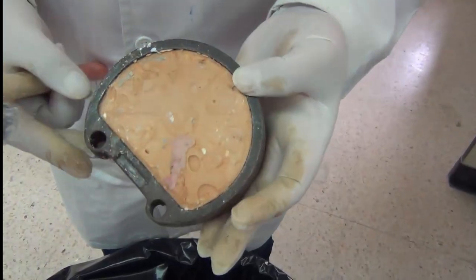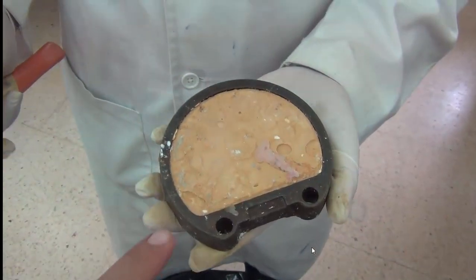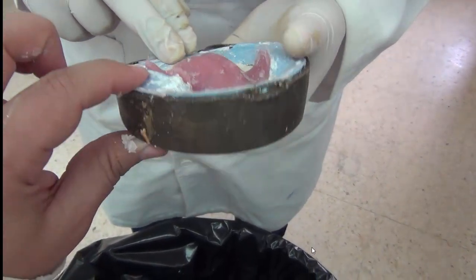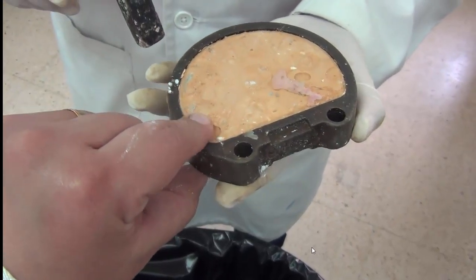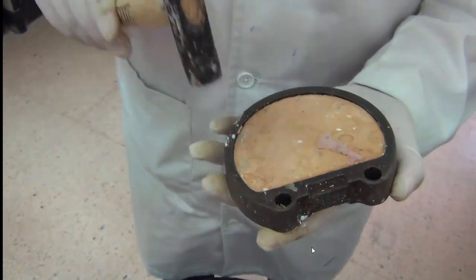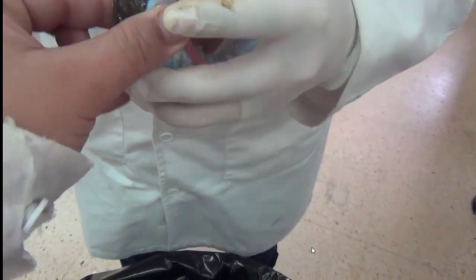Now this is the upper part of the flask, and you can see that it has a wedge shape. So it's narrow from here and wide from here. To separate this from the metal, it's better to go to the narrow side and push the stone through the edges. So we try to hammer. Okay, loosen it like this, and then once it's separate, we turn it out like this.